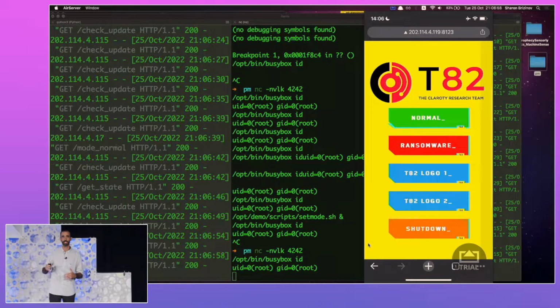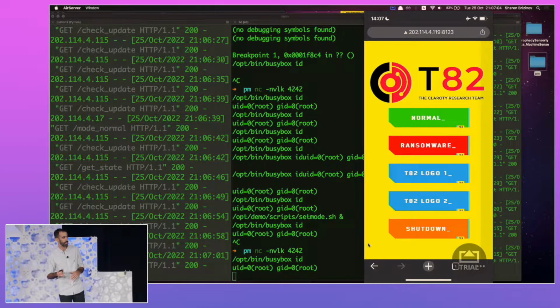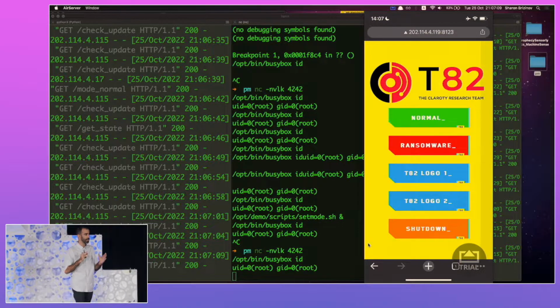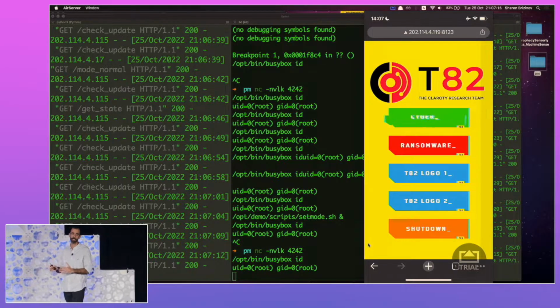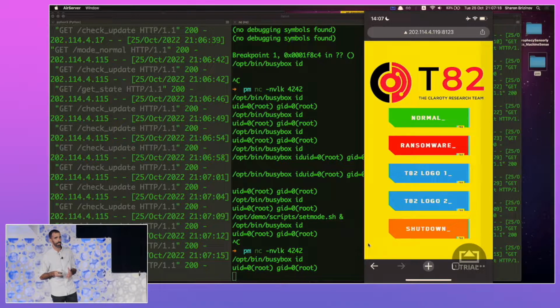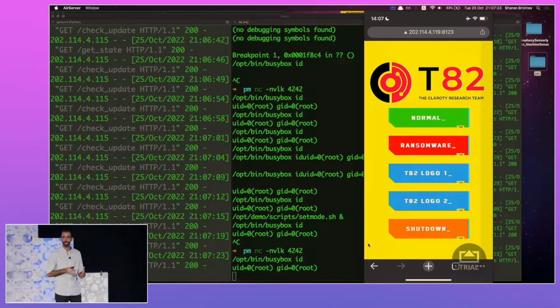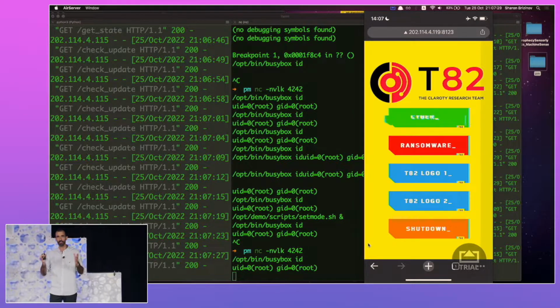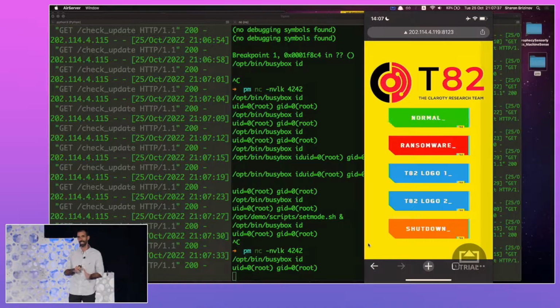The reason why we decided to actually focus on embedded devices is because taking into account the COVID task force report, which Josh actually led, and I think it's one of the interesting pieces because it actually shows the connection between CPS, cyber physical systems, and cyber attack. All of us are aware of the fact that ransomware actually can attack IT, and I think the COVID task force was actually showing the connection between attacking IT and how it actually influences the healthcare systems. But what they focused on is mainly what everybody trivially understands: digital records, such as patient records and other supportive systems where everything is being stored, are the classical target.